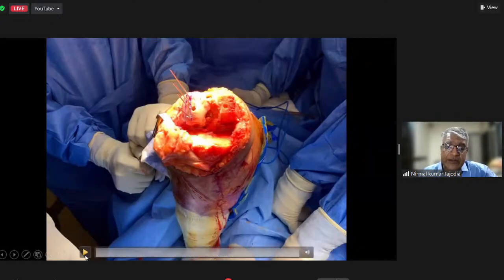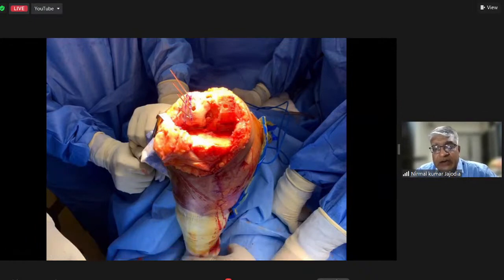Now, this is the video of the procedure that this patient required. We did an iliotibial band and a posterolateral corner release in extension, but the knee was still not balanced. At this point, we wanted to assess what is the residual component of deformity by the collateral ligament and the popliteus. And when we did the component internal rotation and we chose the gap balancing method, we were still having a large amount of tightness. Hence, we decided that the structure which was contributing was the collateral in the IT band, collateral in the popliteus, because there was a tightness both in flexion and in extension. And at that stage in the surgery, we decided to go ahead with an epicondylar osteotomy.